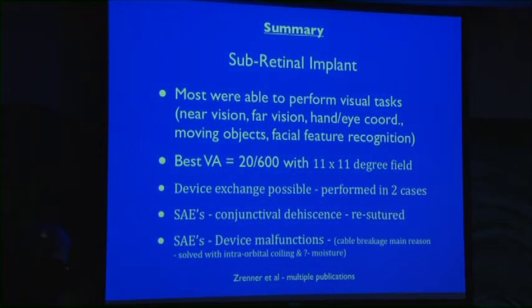So these implants have been placed now in the past 5 years in close to about 30 patients. And so these are patients, again, like you've all been talking about, where the outer segments are gone, but there are still working cells. So these are transmitting an electrical impulse created by light to the remaining cells. So the remaining cells are still functioning pretty well.